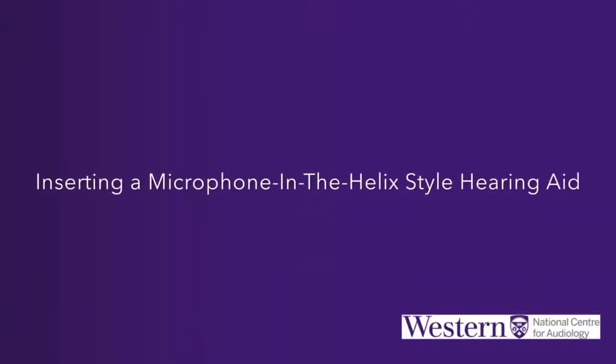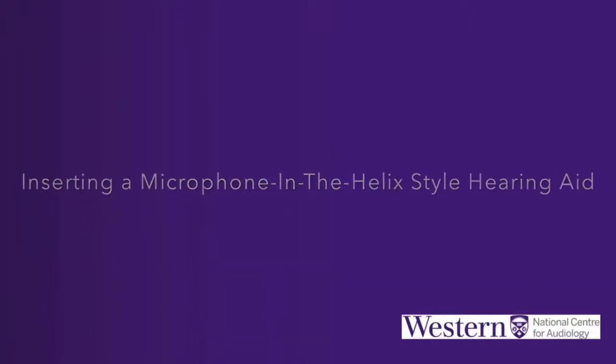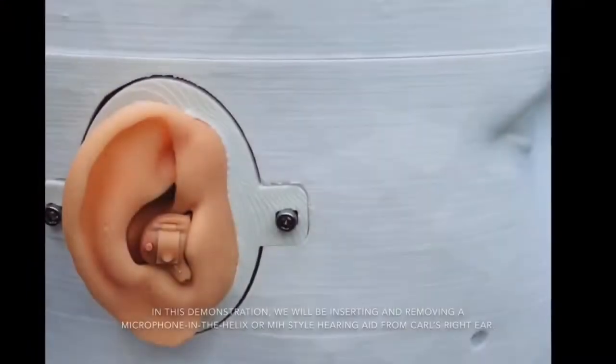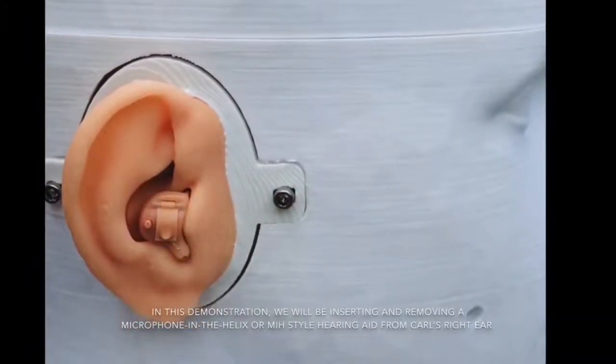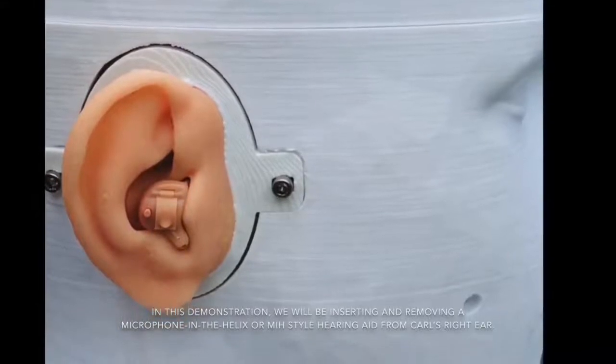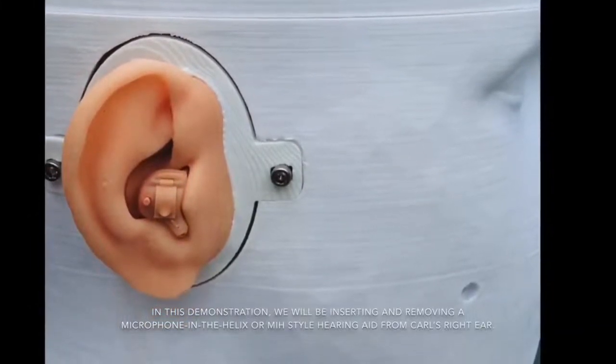Inserting a microphone in the Helix-style hearing aid. In this demonstration, we will be inserting and removing a microphone in the Helix or MIH-style hearing aid from Carl's right ear.